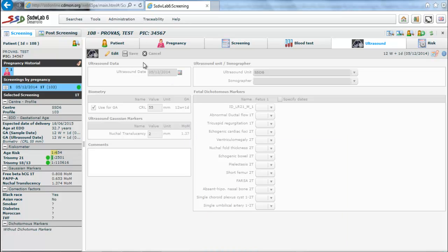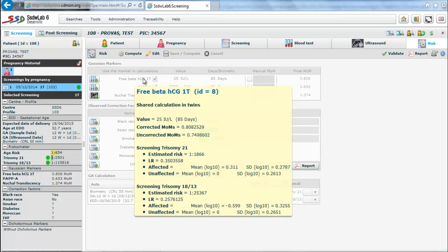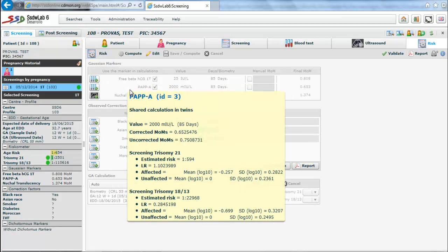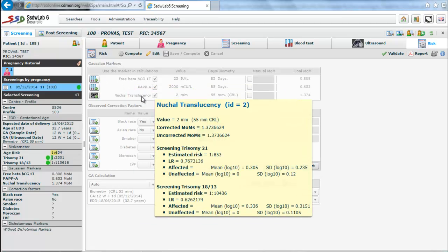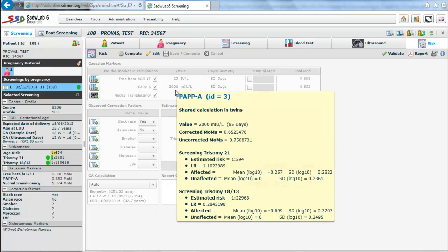And finally we come to the folder called risk. We find on the top of this folder information about the Gaussian markers used in risk calculations. Thus we see the values of the markers and their respective MOMs.